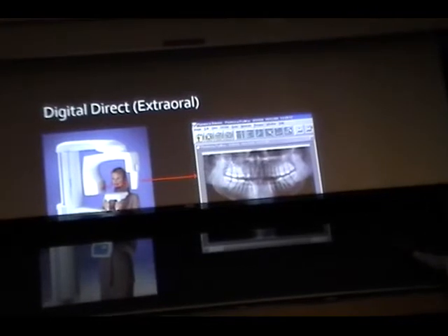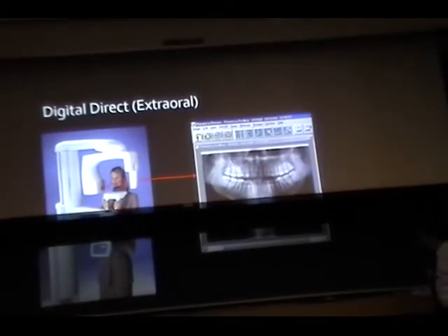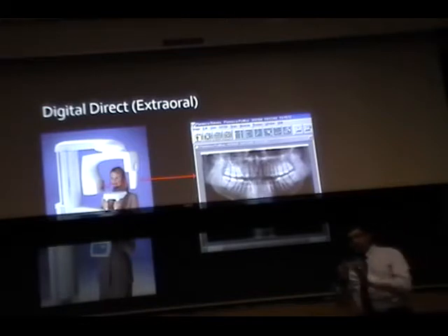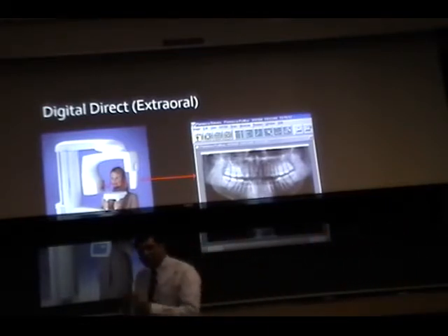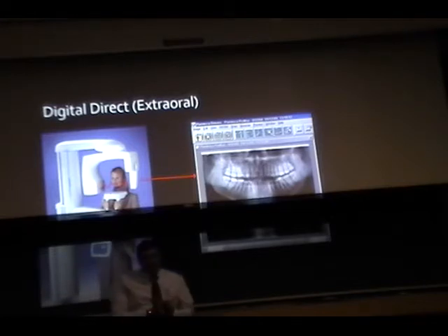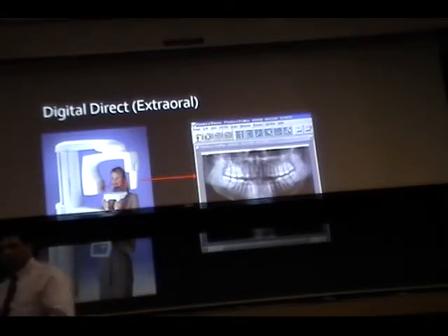So you have to give more radiation for this or this. Why? It's a smaller pixel. You need more photons because it's a smaller pixel, so the absorption will be a little less, so you have to give more radiation. The downside is that if you're using flat panel detectors, you have to give more radiation to the patient to get a crispier image.